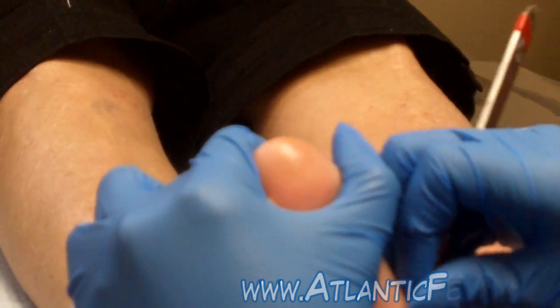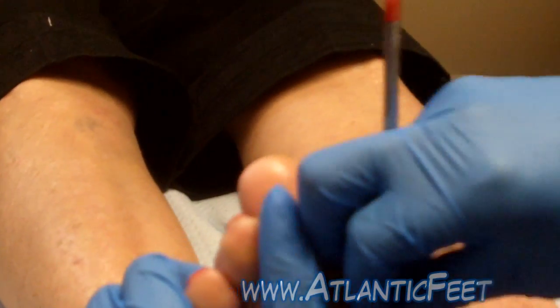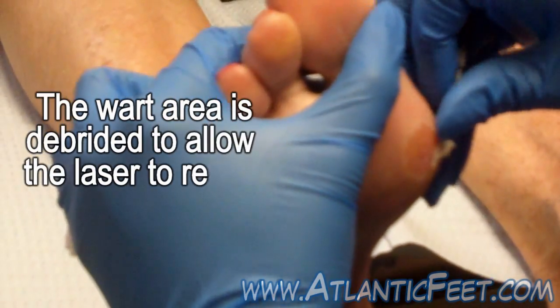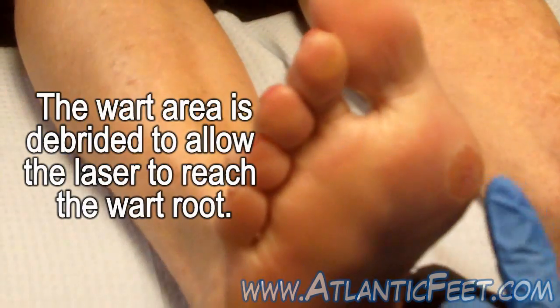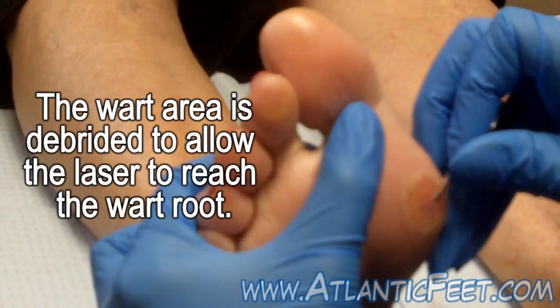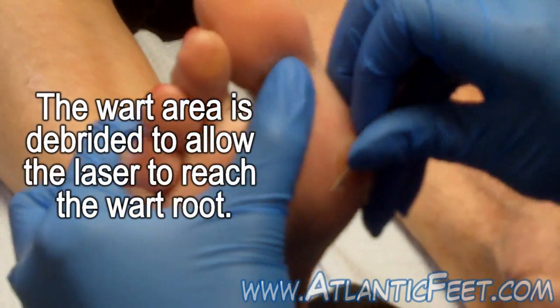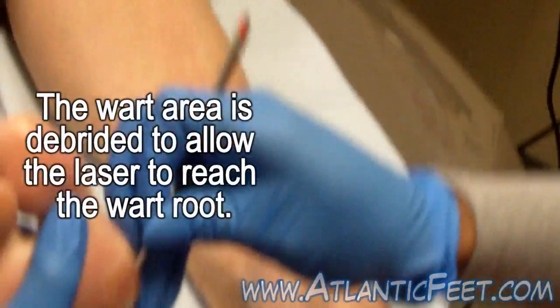We're removing the excess skin to get to the wart layer so the laser has less work to do. It makes it more efficacious and we can hit right on the actual verrucous tissue.